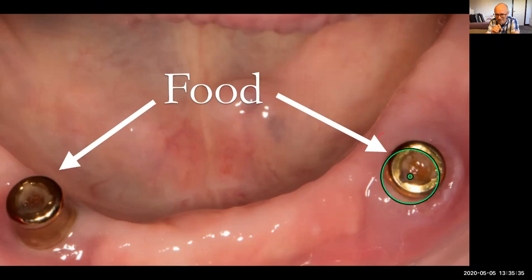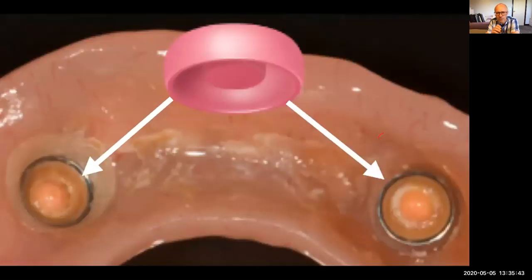So that it just gets packed in, like seeds and raspberry seeds and strawberry seeds, etc. And it just means that rather than the attachment looking really nice like this, all of this bit here just gets smashed up and mashed, and the whole thing, the denture, does not seat properly. So what I do with these circumstances then, so like this for this patient here, for Mary.